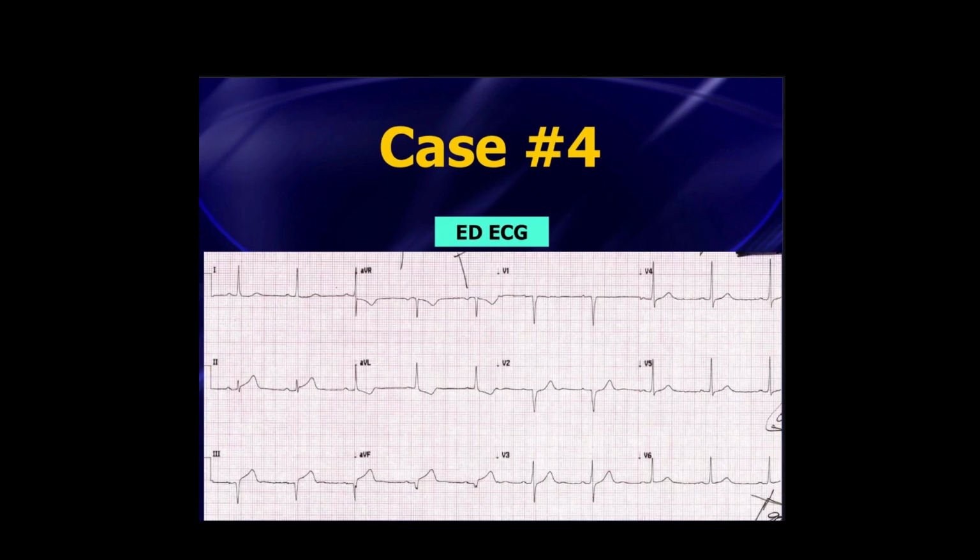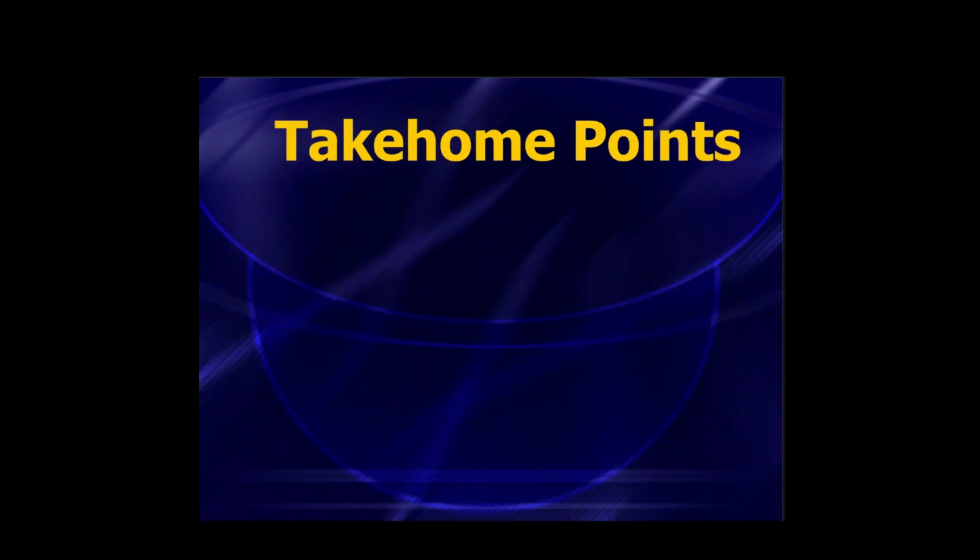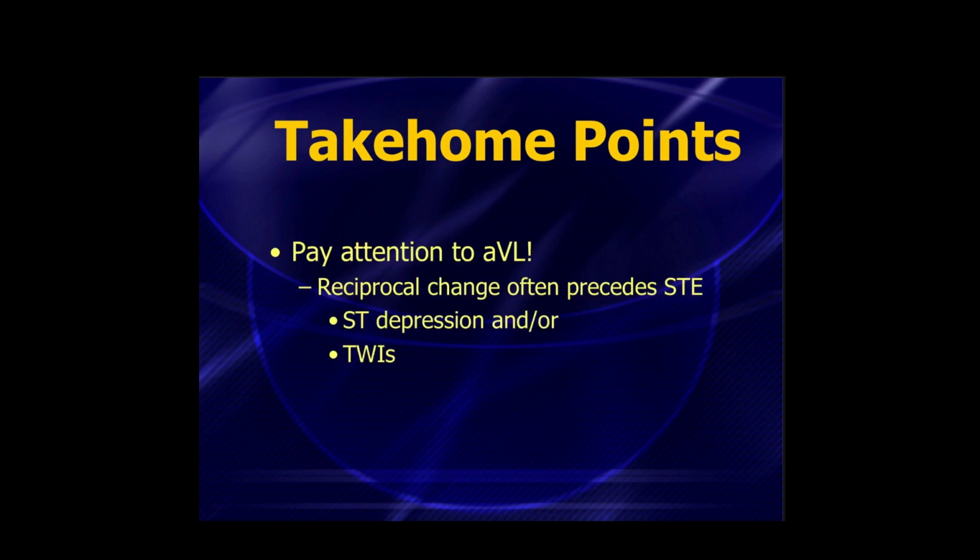Patient arrives, Todd grabs the new ECG, and sure enough, now there is full-blown ST elevation in lead AVF, lead 3, lead 2. This is a full inferior wall STEMI, and the first thing that predicted it was nothing more than a new flipped T-wave in AVL. This patient went up to the cath lab and had a 99% RCA lesion that had to be opened. So 4 simple cases, Dan, are one key point. Gosh, I know you're going to see cases like this. It's just so common. People have sent me dozens of cases of AVL predicting inferior wall STEMI. It's that common. It's out there, and your computer will not pick this up.